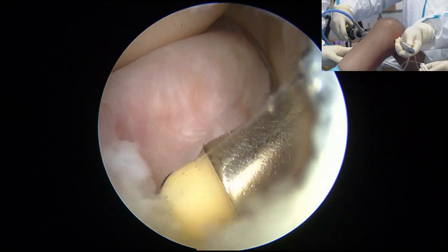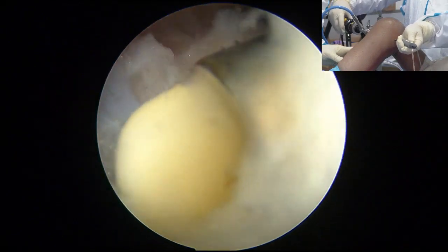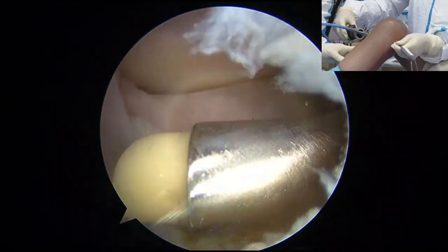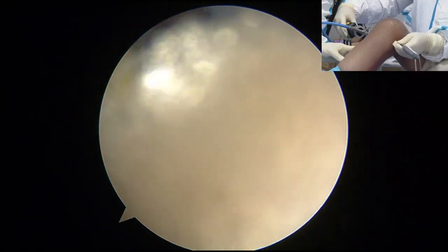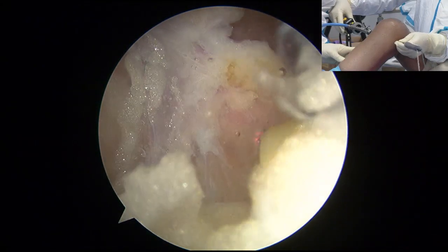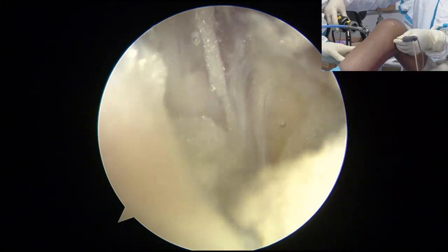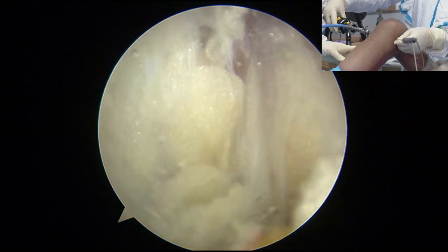So we clean this a little bit. Careful, do not cut into the meniscocapsular junctions. Okay, go down. When cleaning, be careful to protect the meniscocapsular junction and avoid injuring it. Okay, here you remove this. Take that one. Okay. Go. Okay, stop. Okay, so you slowly clean this until you see the footprint. Okay, go. Then we see the PCL footprint.